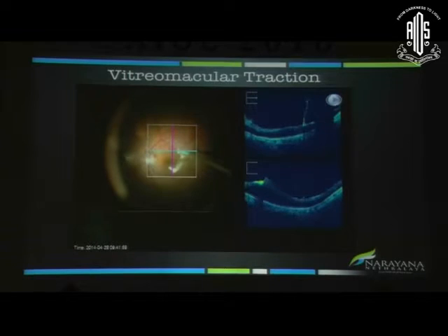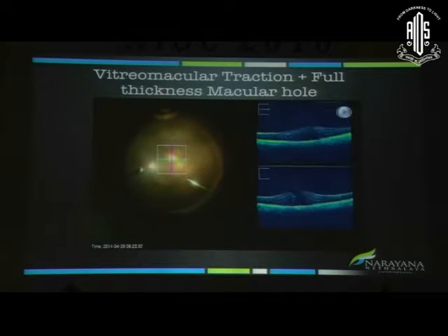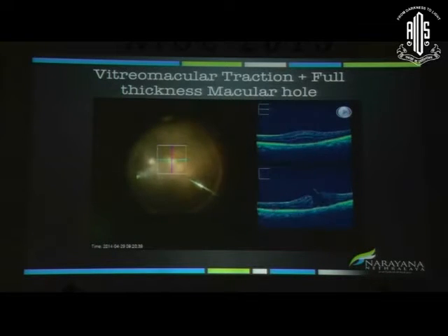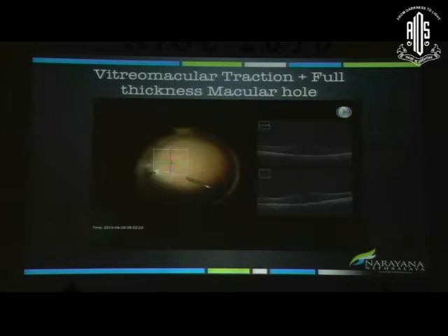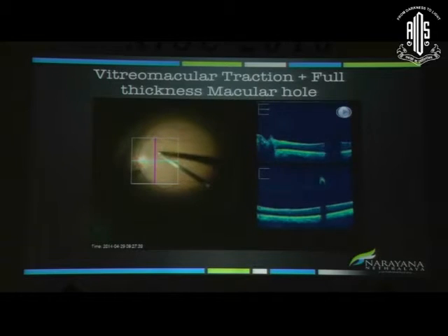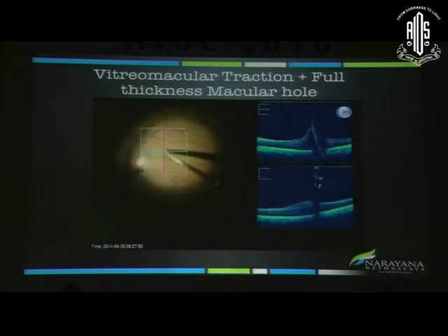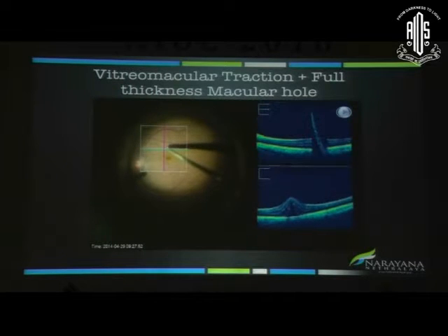So you can actually see the membrane being lifted off the retina. This is a case with a macular traction with a full thickness macular hole. Here again inadvertent nerve fiber layer touch or breaks can be avoided. We can also do away with staining or using vital dyes, as the peeled ILM is very well visualized as a scroll membrane. I'll show you some more images later.